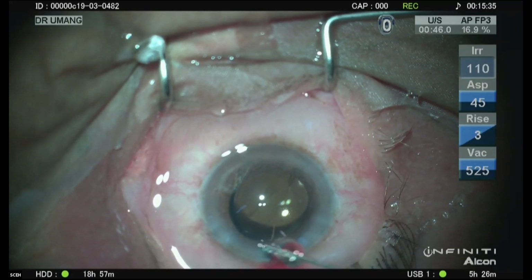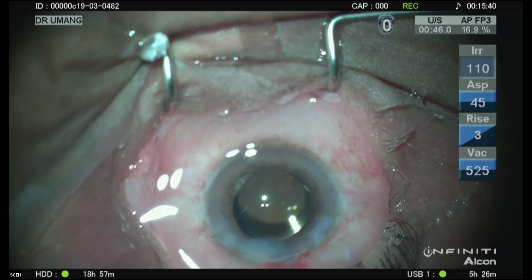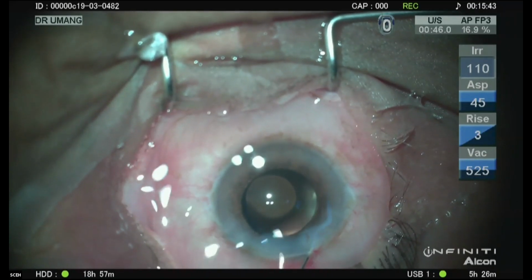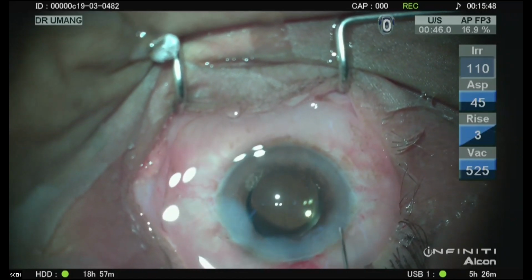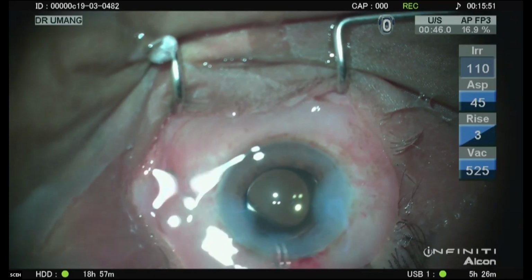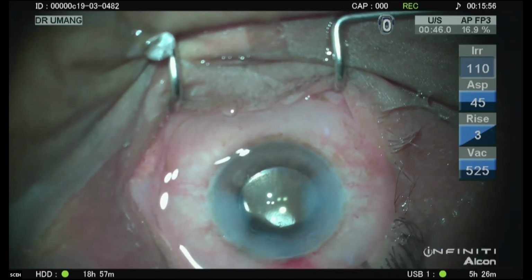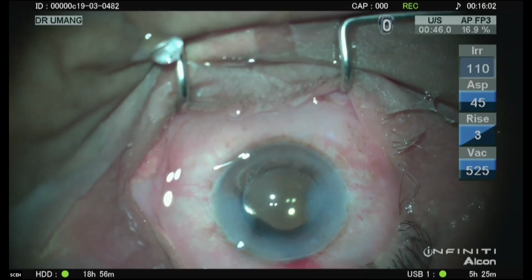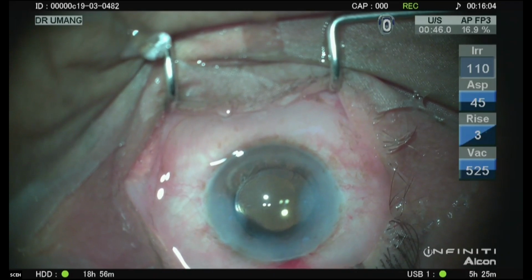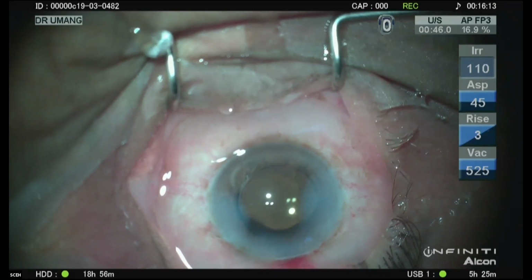And now it's important to make sure that our wound is well sealed, it's watertight. We hydrate the incisions and make it nice and taut. Right, so this is how we use different steps in the machine. And as we prepare for the next case, I'll be happy to take some questions.